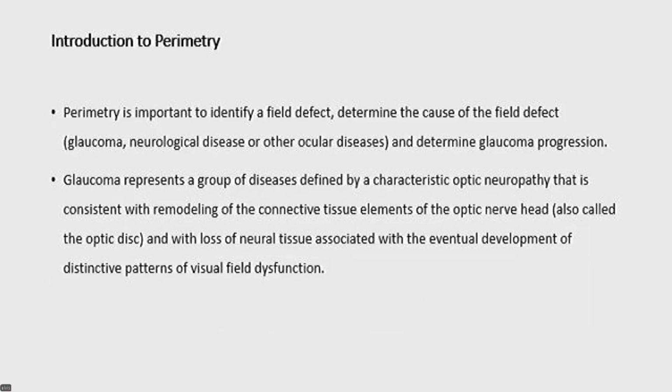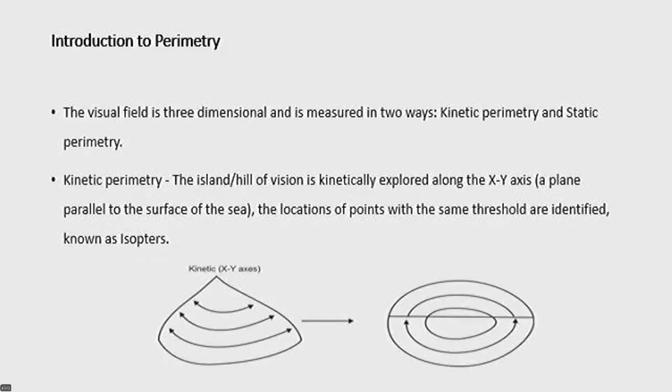progression. The role of perimetry in glaucoma is very important, linked to the definition of glaucoma, representing a group of diseases with characteristic optic neuropathy and, functionally, distinctive patterns of visual field dysfunction. So herein lies the importance of perimetry to glaucoma management.